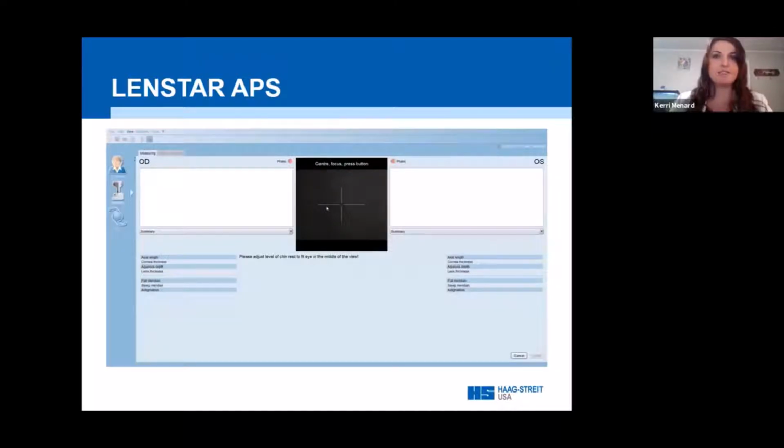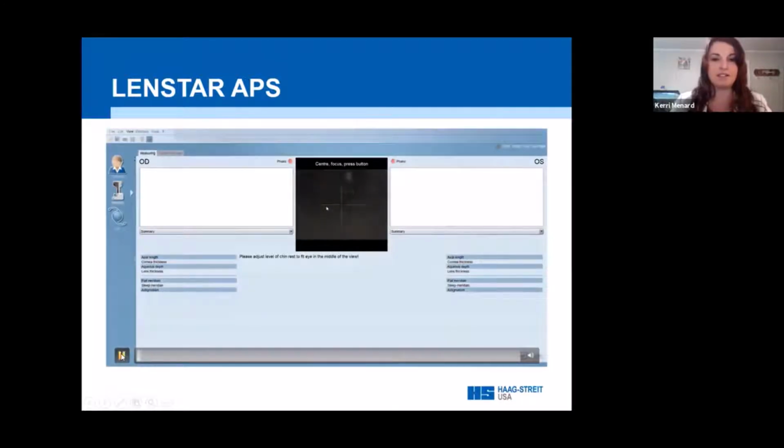So let's jump right into measurement acquisition and then discuss cautions on your measurements. Here are measurements taken in APS. Notice the technician will start defocused, meaning all the way back closest towards them, and they're going to move closer towards the patient until those 32 circles, right in the front of the cornea, start to look crisp and clear.